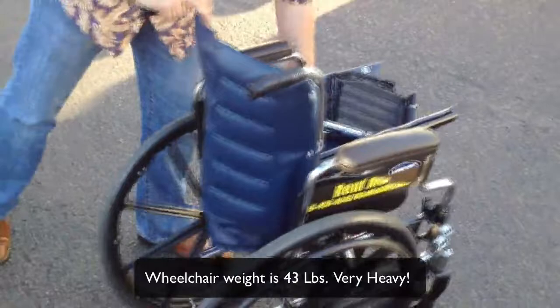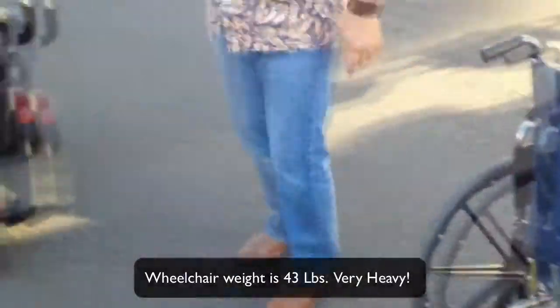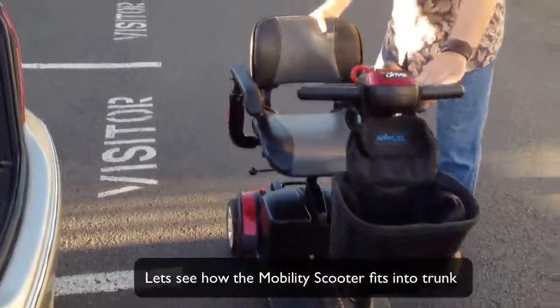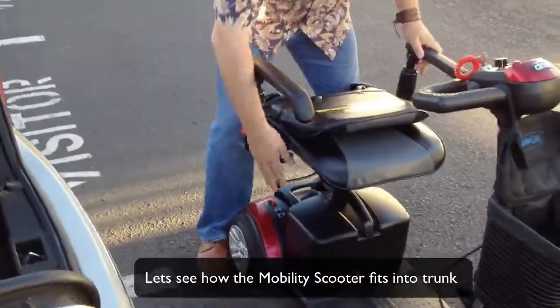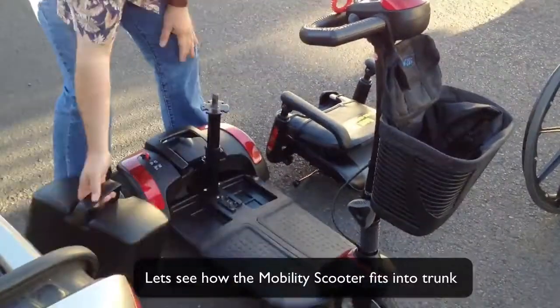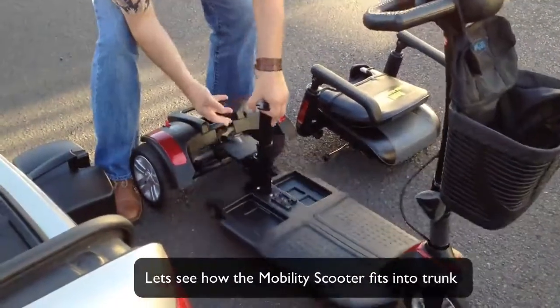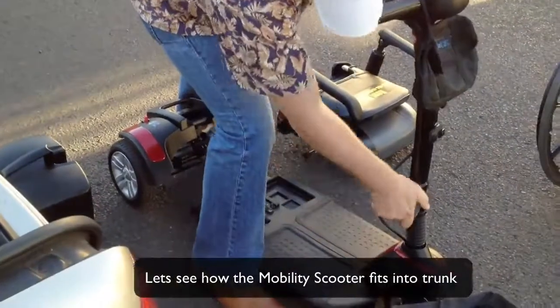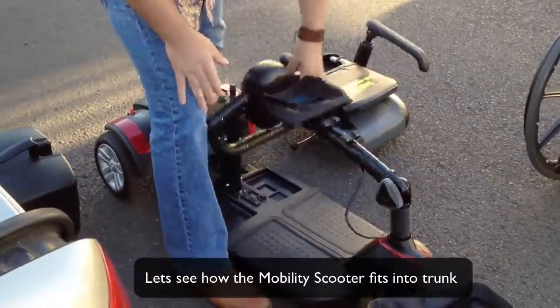Those are the footrests. Let's check out the mobility scooter. This is a 20 to 30 second disassembly. The heaviest piece is probably about 23 to 25 pounds — not too bad, completely manageable.